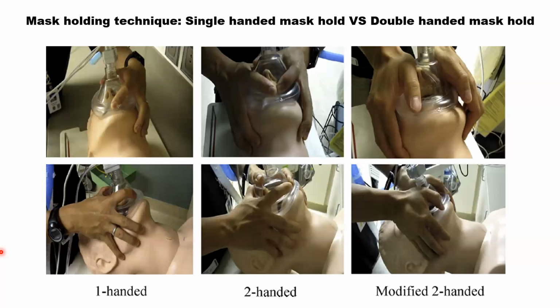Okay, I still can't get it, Dr. Husna. Still can't get chest expansion. You're bagging the patient, you can't get a chest expansion. What's next? Next we have the supraglottic airway.